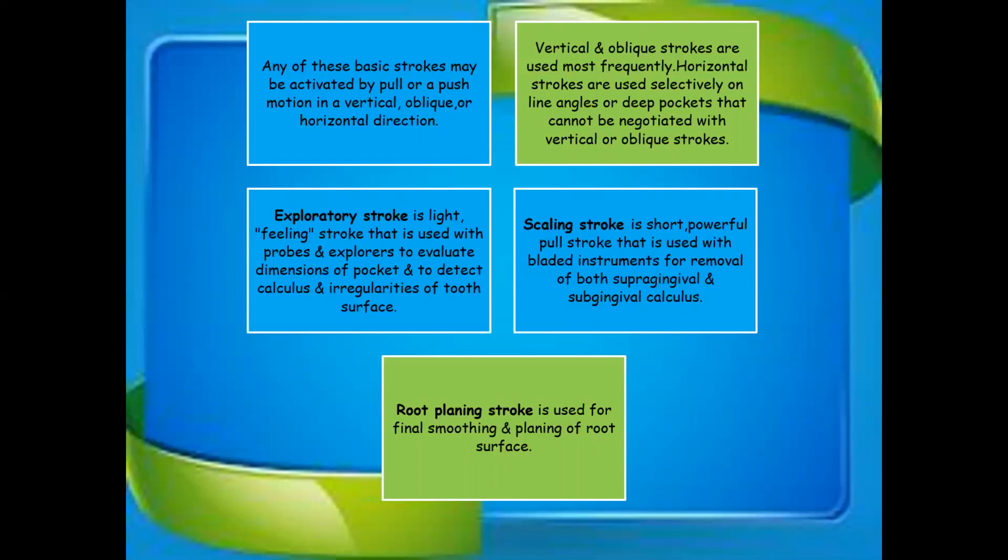Scaling stroke is a short, powerful pull stroke that is used with a bladed instrument for removal of both supragingival and subgingival calculus. The third one is the root planing stroke, which is used for final smoothing and planing of root surfaces.